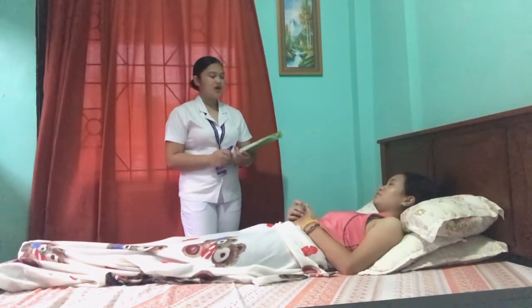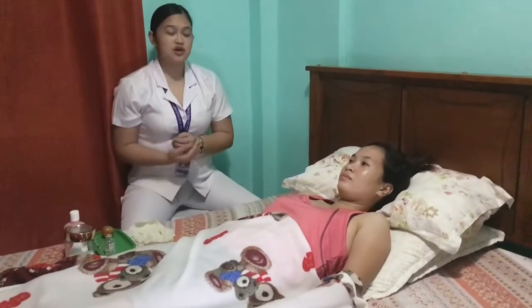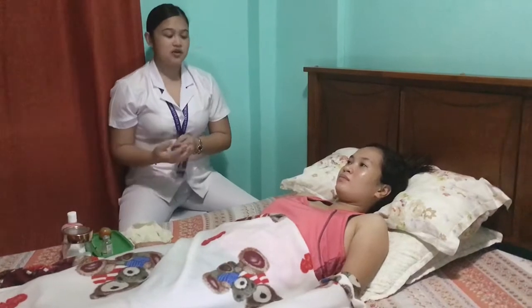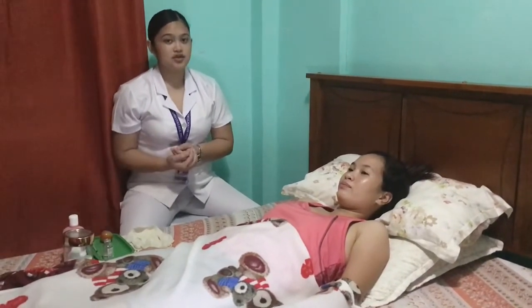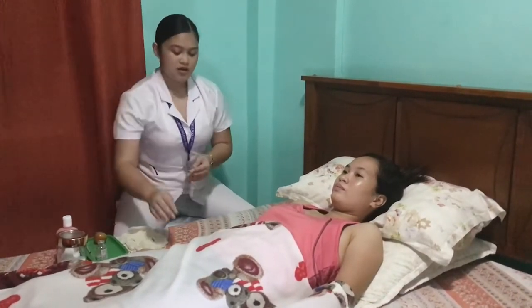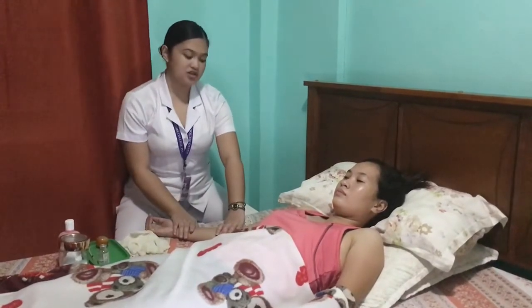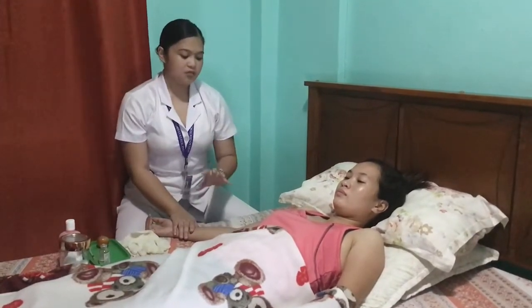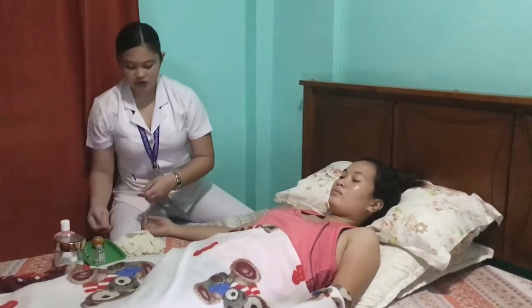Yes, sir. Okay. So now we're done preparing the medication in the procedure of intradermal injection. So let's choose an injection site which is free from lesions or skin discolorations, which is below the antecubital space and one hand above the wrist here. So place the patient's arm so that the elbow and forearm are supported by a flat surface. Then apply clean gloves.